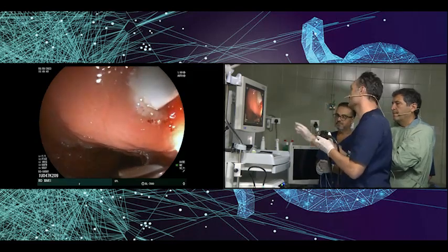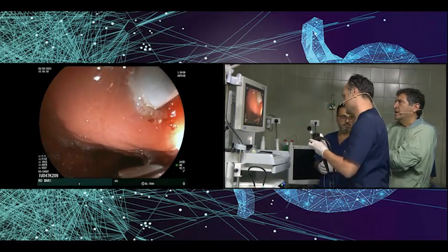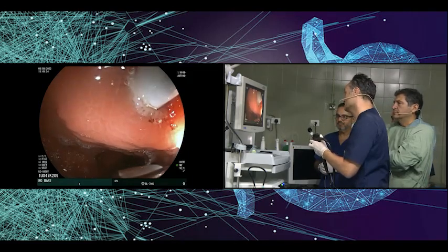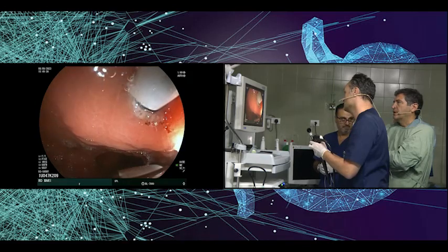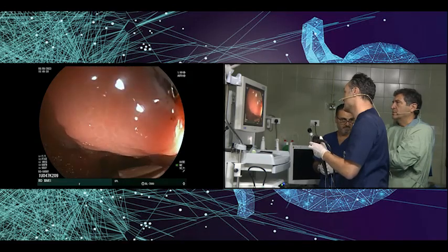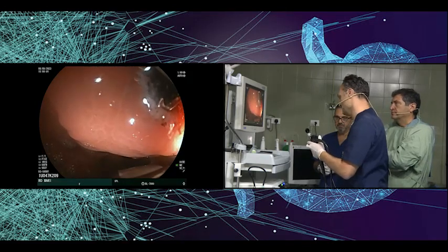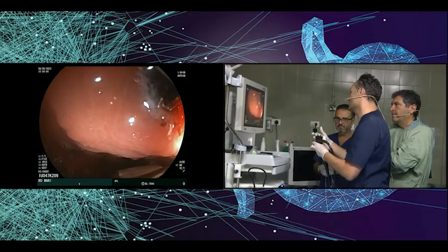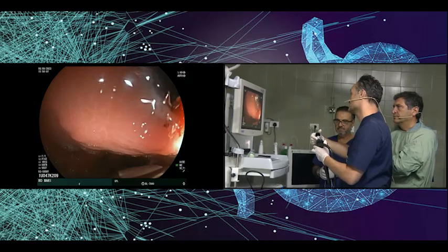Okay, so here we have a great view of the catheter. You just have to pull the catheter a little to observe the black ring, which is here. When you have the vision of the black ring, you can deploy the proximal flange.